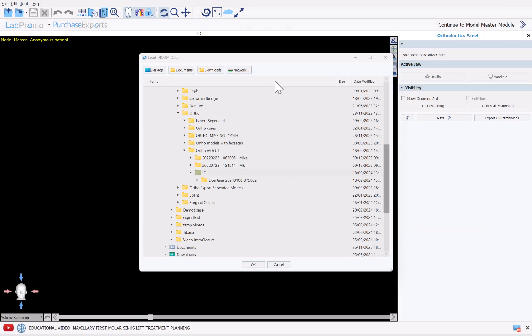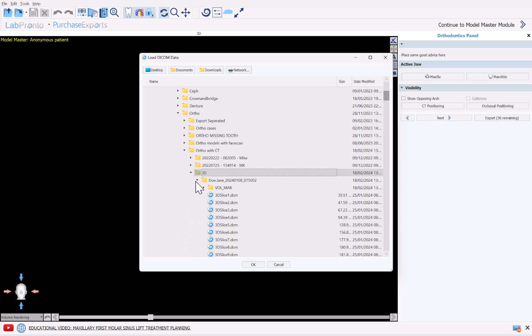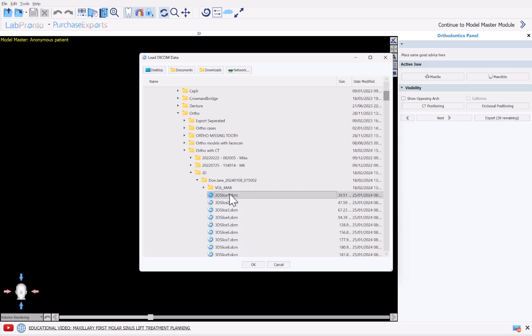The software is now prompting us to select the relevant CT scan. Navigate to the location on your computer where the patient CT scan is saved. You could use the shortcut buttons going across the top for quick navigation. You're able to load zipped, unzipped, compressed, or uncompressed DICOMs into the software.